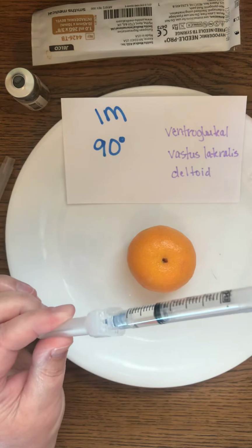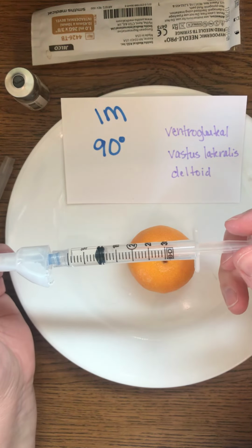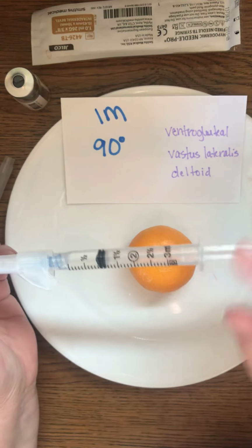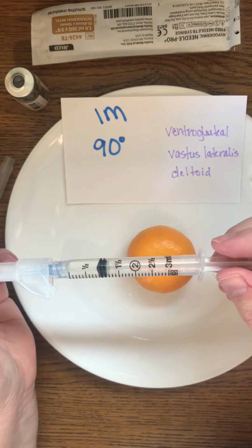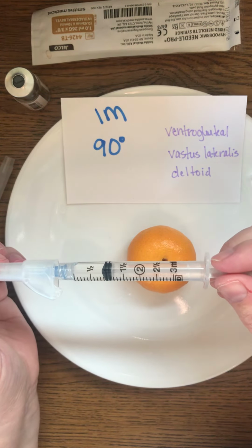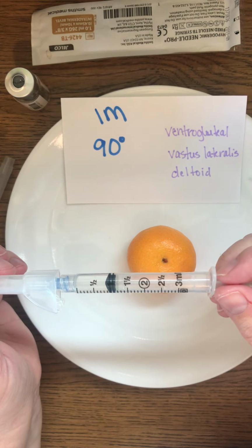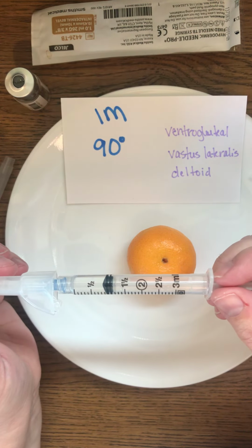So 1 to 5 mils is the recommendation for the ventrogluteal and the vastus lateralis sites. You can inject all the way up to 5 mils, which if you think about it is a lot, because this is only a 3 mil syringe. Usually I typically only see 1 mil to maybe 3. For the deltoid, it is a smaller muscle, so you can't inject quite as much. So 1 to 2 mils is going to be the most you're going to inject into the deltoid muscle.